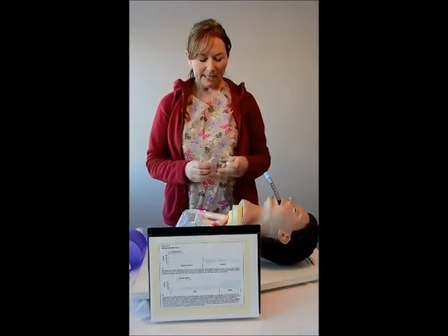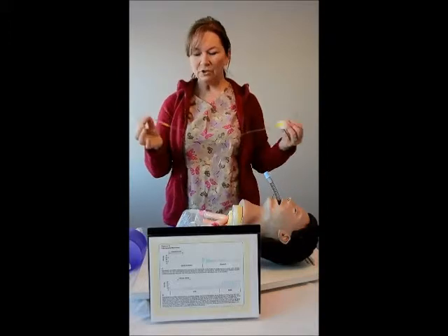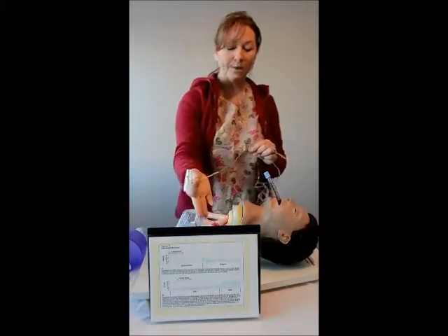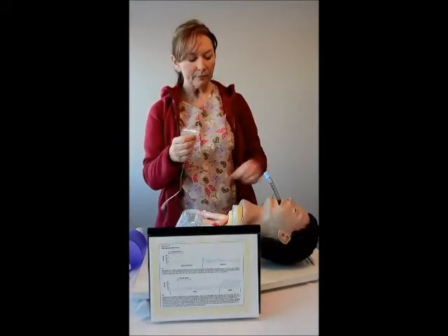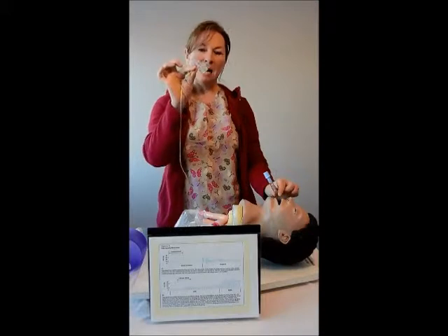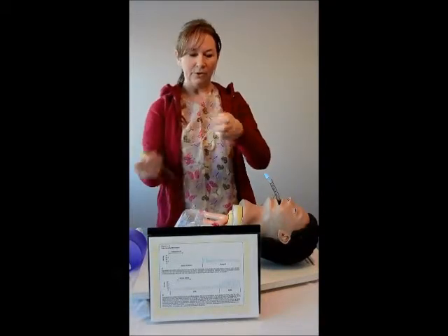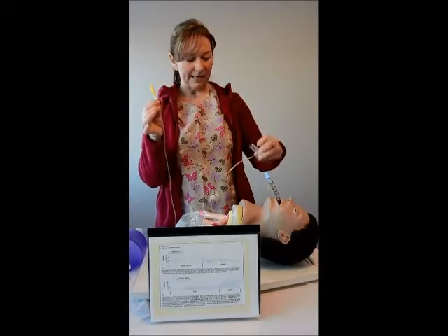For hospitals that are equipped with continuous waveform capnography, this is just one of the devices that's out there on the market, and there's a picture of what the waveform is going to produce once this is all hooked up. With the endotracheal tube, I take the one piece, and you can see there's only one way to connect this. Okay, doesn't fit like that.